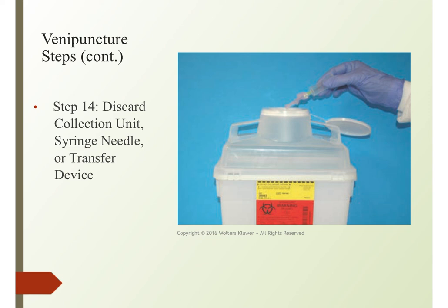We're going to discard the whole needle unit, transfer device, whatever we use. We're going to dispose of that in the sharps container if it's sharp.